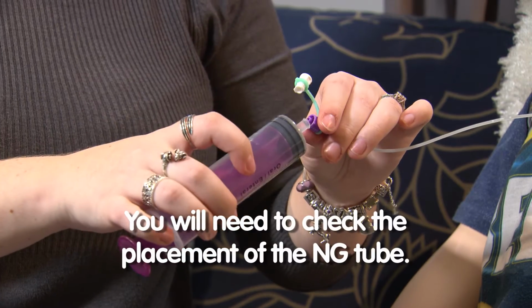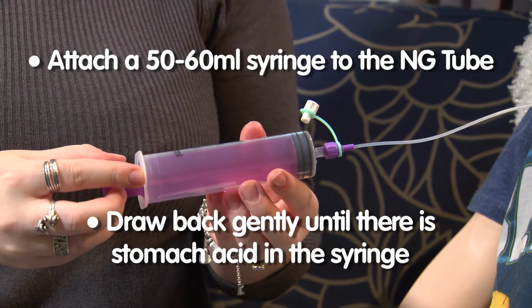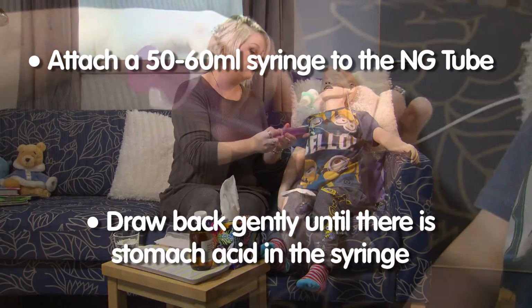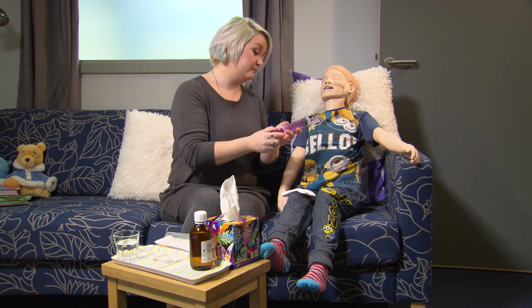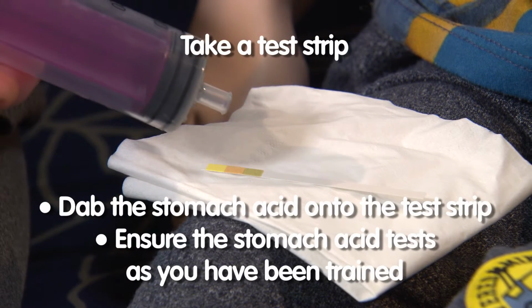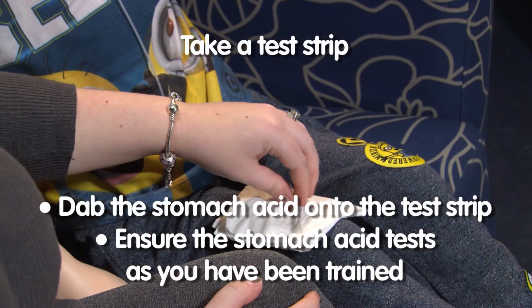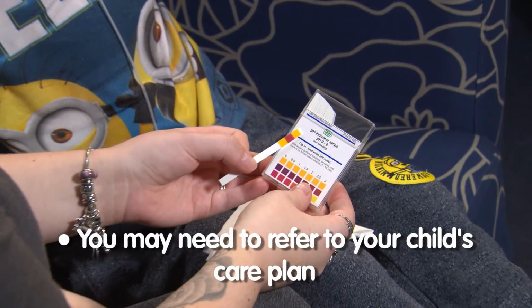Before giving the medicine, you will need to check the placement of the NG tube. Attach a 50 or 60 ml syringe to the NG tube and draw back gently until you get stomach acid in the syringe. Take a test strip and dab the stomach acid onto the test strip and ensure it tests as you have been trained. You will need to refer to your child's care plan.